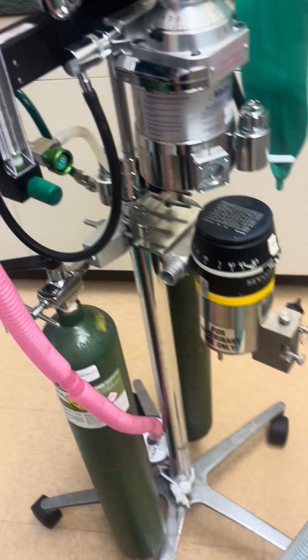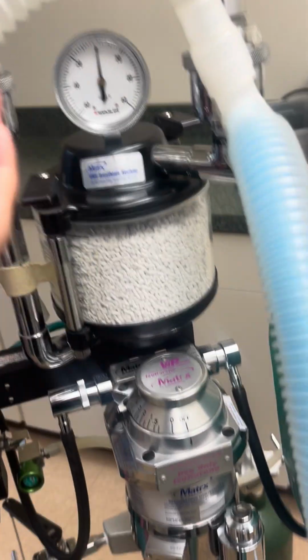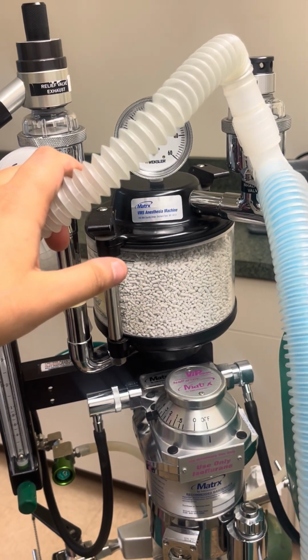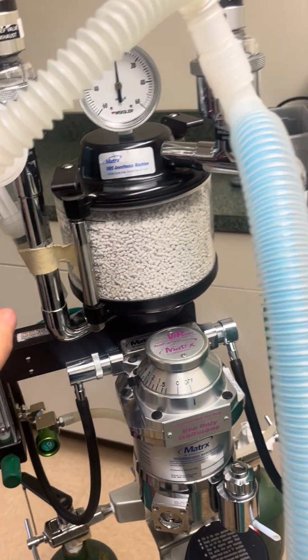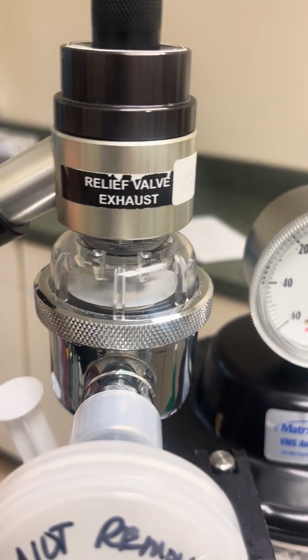Our 14th step is our exhalation tubing. The exhalation tubing, for one, it's bendable, so that's nice. And it carries respiratory gases with volatile anesthetics to and from patients during general anesthesia. All right, and then we have our exhalation valve.